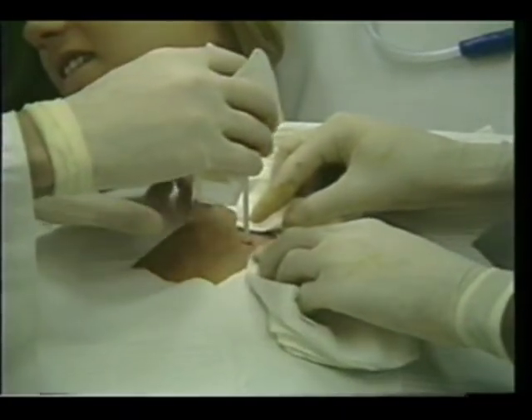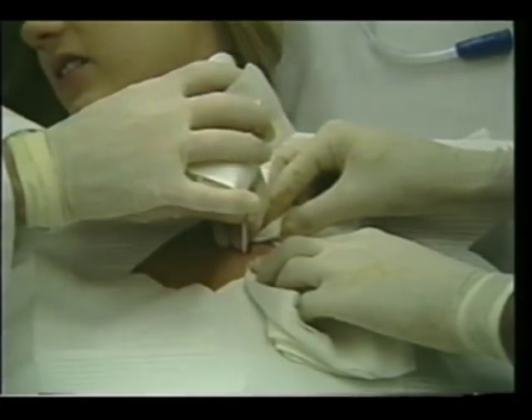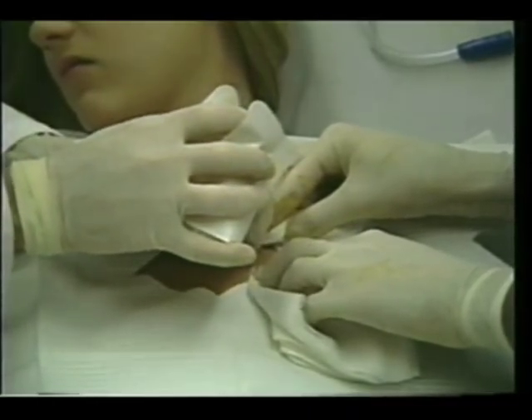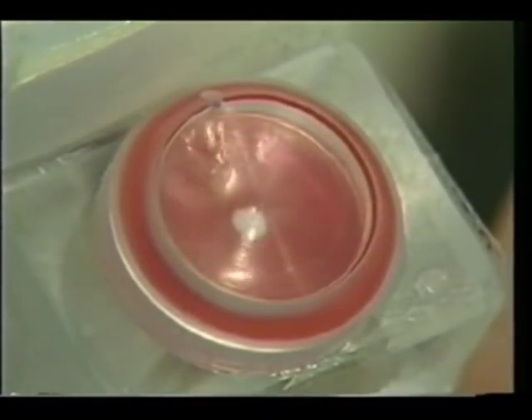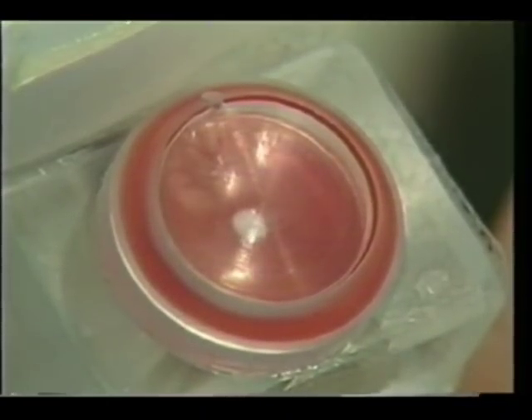Grasp the thoracic vent in the most comfortable manner with the thumb or first digit over the trocar handle. Then position the device and gently introduce the trocar-catheter assembly through the incision, staying immediately above the superior border of the lower rib.